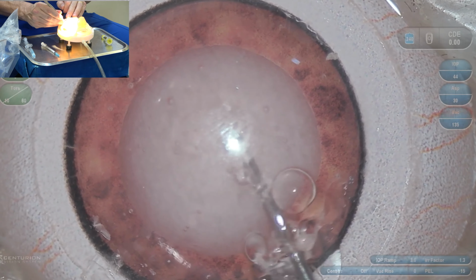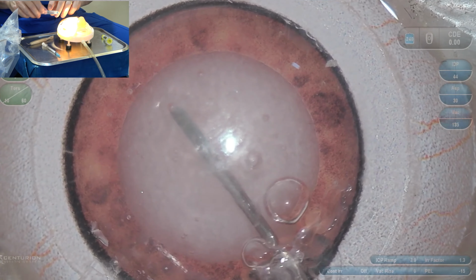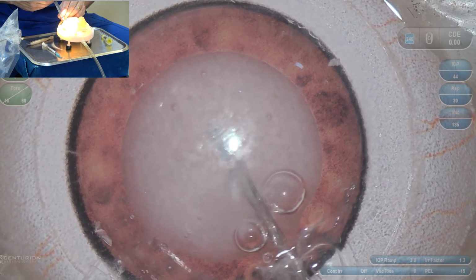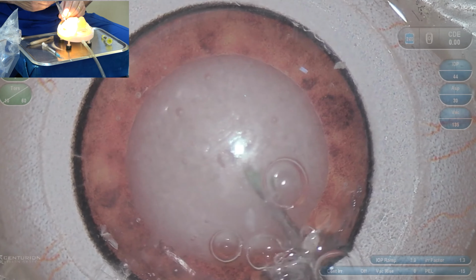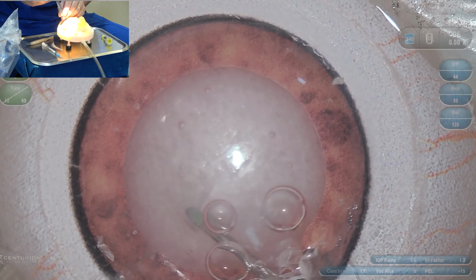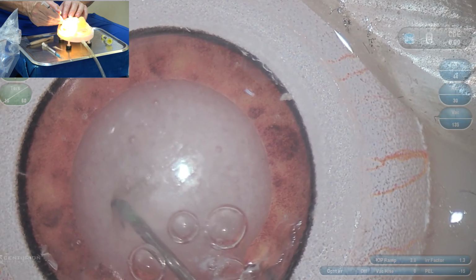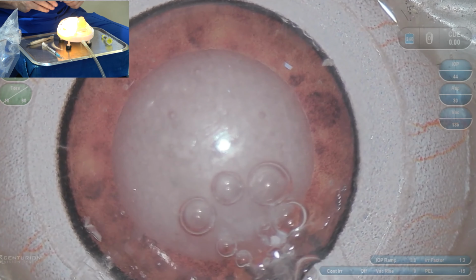And then we're going to do a sculpting and quadrant removal. Okay, so I go in down a little bit. I will do it there. Can you see it? Perfect. So the nucleus is completely free and in the bag, moving freely.